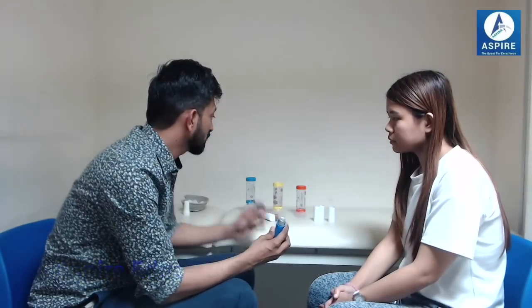We might think asthma symptoms are not controlled and the medication is not enough. Usually, people having acute exacerbation of asthma have this problem because they don't know how to use the inhaler correctly. The main reason is not knowing the exact technique. So make sure we use it properly — one puff at a time.